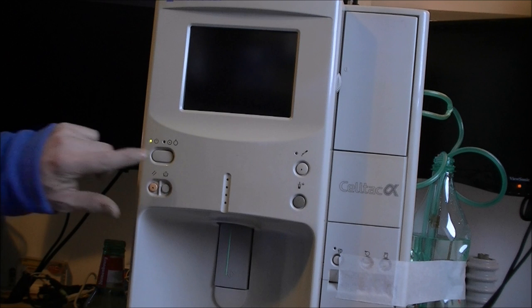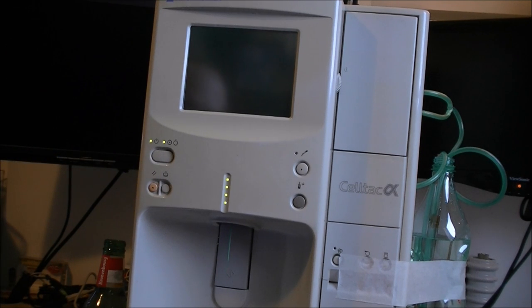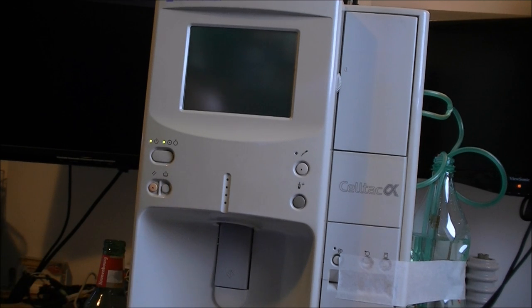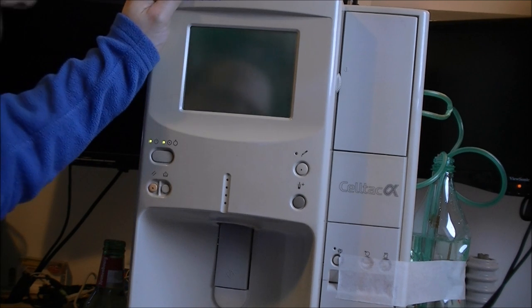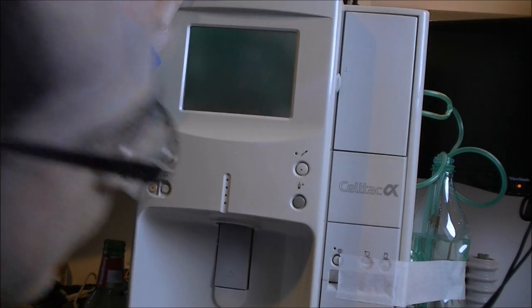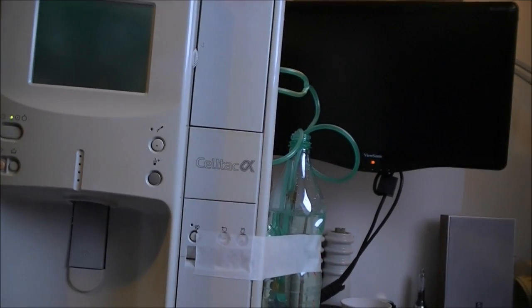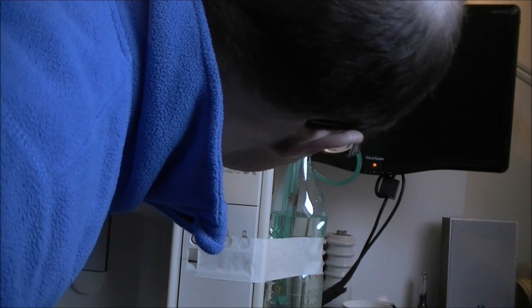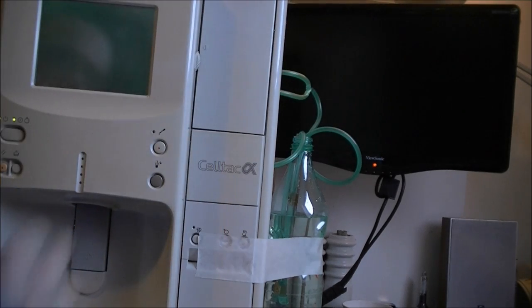But for now, power on. It is lifting the pipes, and actually you have two of them in here. I did already have a quick look inside the machine. As you can expect, it is pretty much full. Oh, we have bubbles on the side, not sure if you will see. Here, we have some bubbling action in the bottle. Not sure if it is sucking anything for now. The thing is really full of pumps.